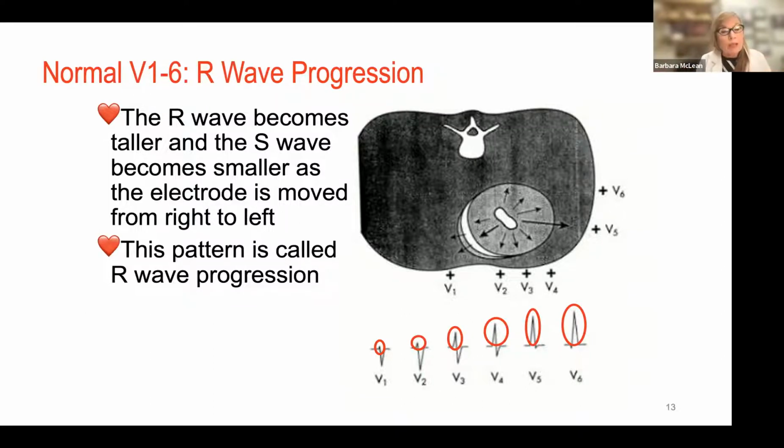Now, there are other things that cause an alteration in R-wave progression. Of course, a big anteroseptal or anterior MI where you've wiped out tissue, it's no longer conducting. All those kinds of things are going to cause problems. But for our purposes today, what we want to be able to do is look at axis and look at R-wave progression and zone of transition: is the direction to the left, and how much time does it take? That's going to be pretty straightforward.